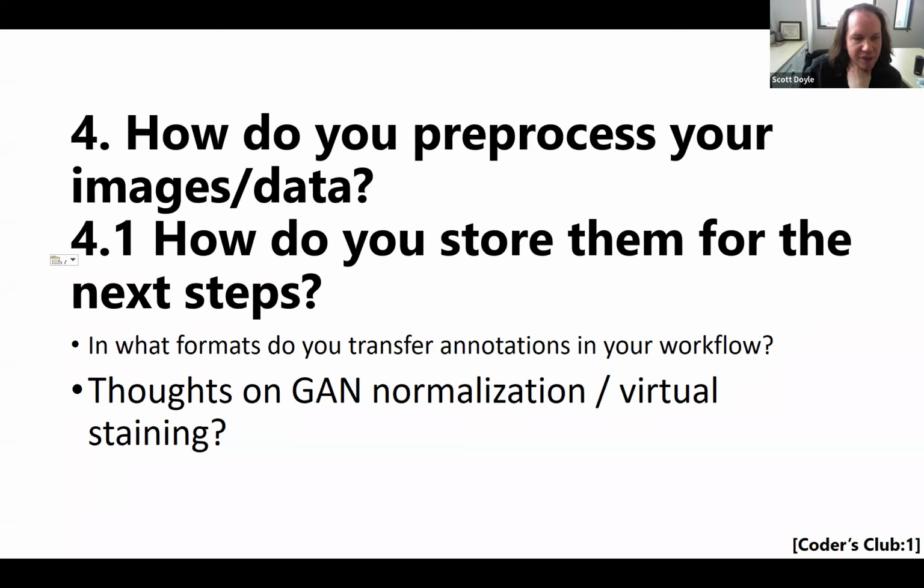We have Olympus slides, VSI slides, and we've had a heck of a time getting them to work with other software. I think they work with QuPath, but they don't work natively with the Digital Slide Archive, so we have to convert them. But I'll see if this works for our slides.